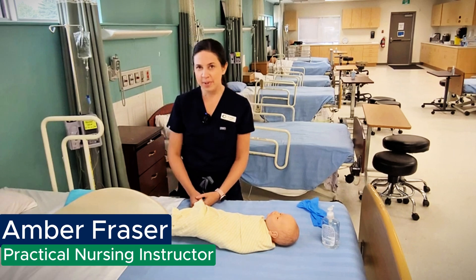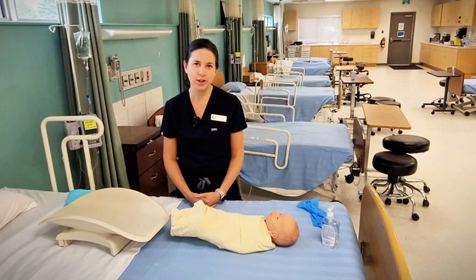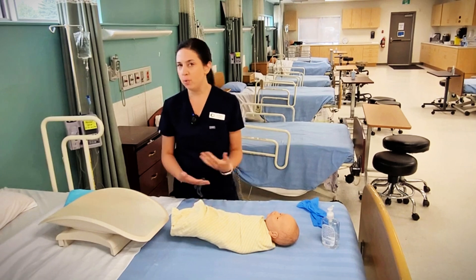Hello, I'm Amber Fraser. I'm an instructor and the lab coordinator of the practical nursing program here at Aulton College, and today I'm going to show you how to weigh a baby.